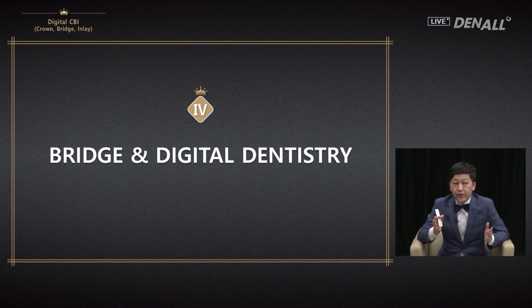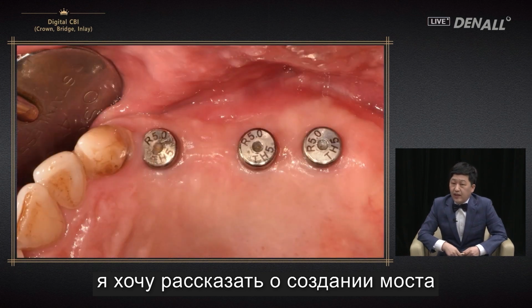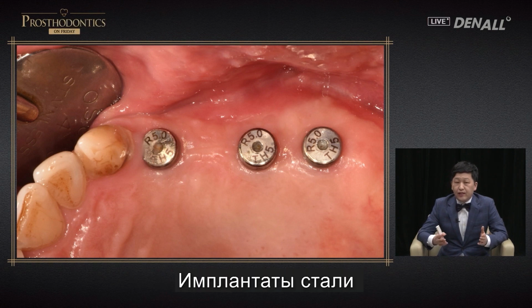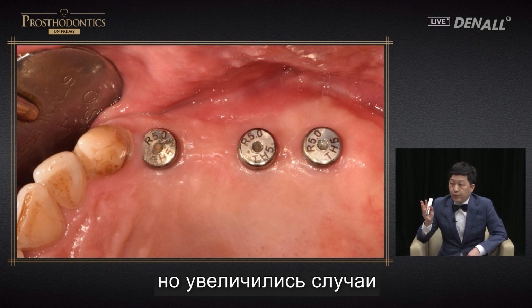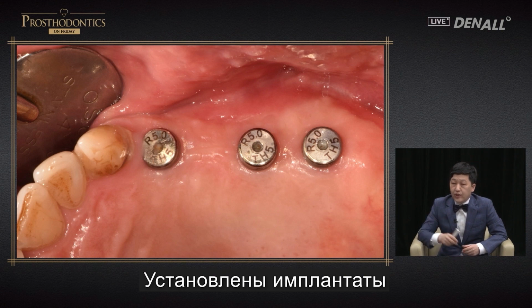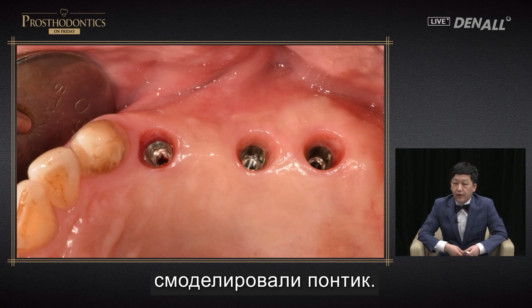Finally, I'd like to talk about making bridge using digital techniques. Implant has become much more common these days, and cases for bridges have decreased, but implant bridge cases have increased. In number 4, number 6, number 7, implants were placed. In number 5, Pontic was designed.